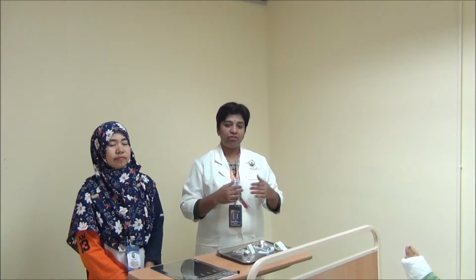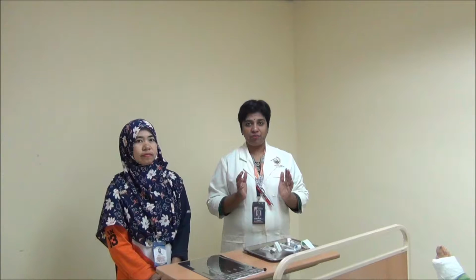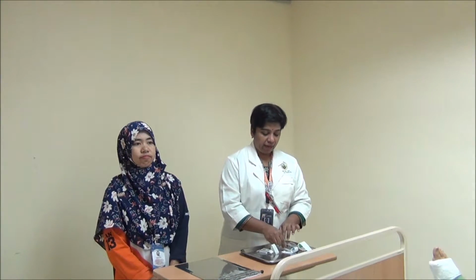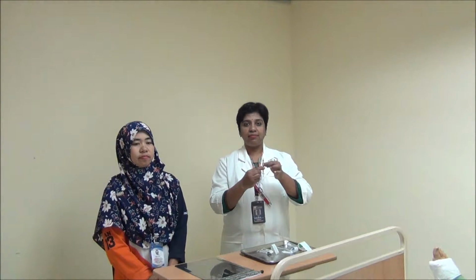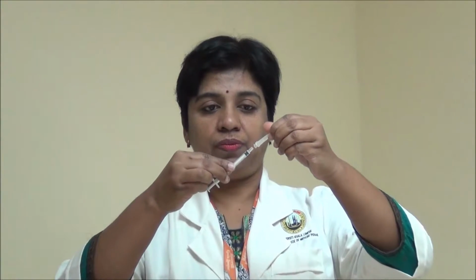So when you are attaching the syringes to the needles, you have to perform a medical rub or medical hand wash. Then you remove the syringe from the packet and attach it to the needle without touching the tip. You attach it like that.